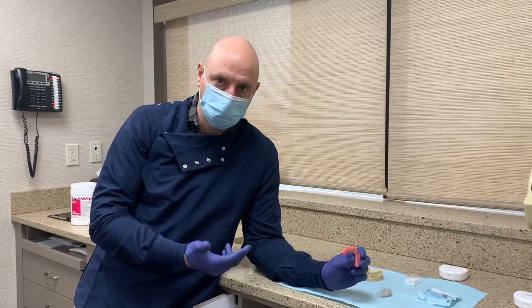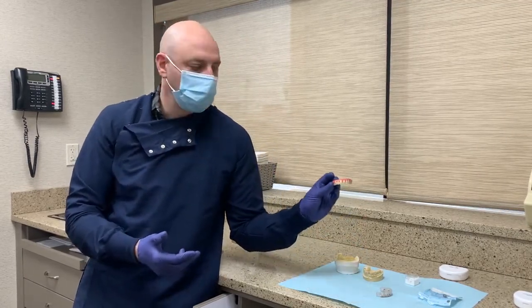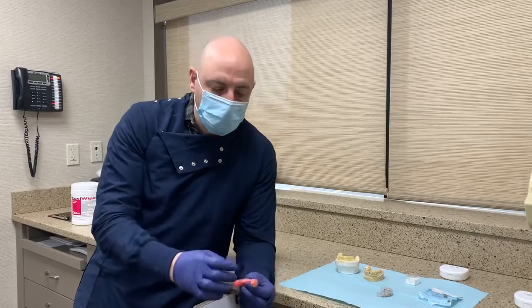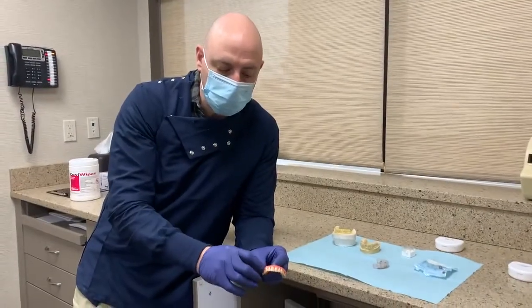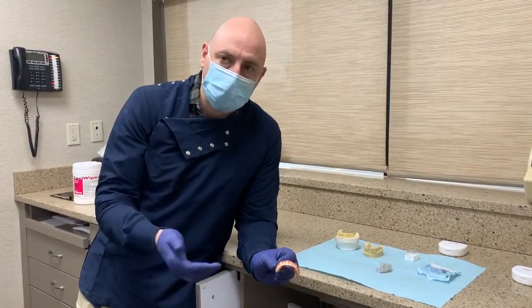That's the reason why. So again, it's only a tooth setup. It's only an occlusal confirmation. It's not a definitive restoration. This is in a plastic or like a resin and a wax. The teeth are set in wax, and so if we need to make any changes or adjustments, I can do that. And we're going to check that right now.